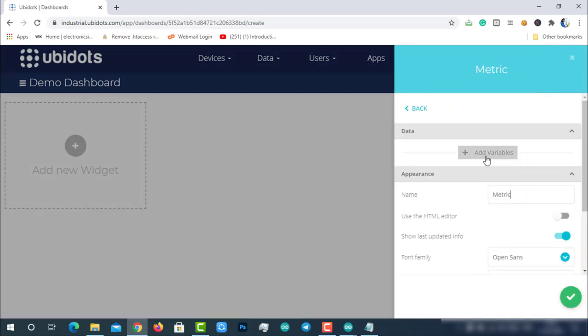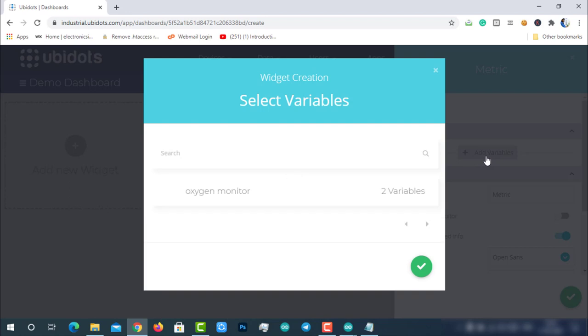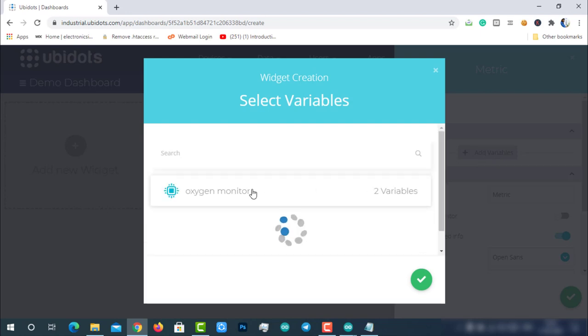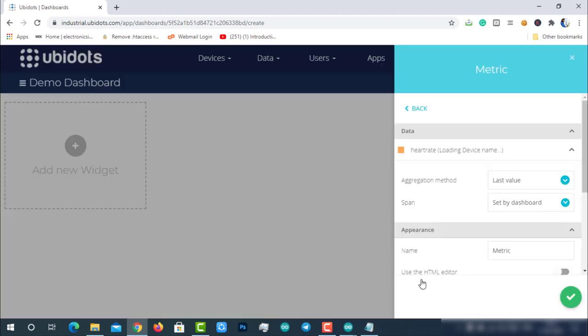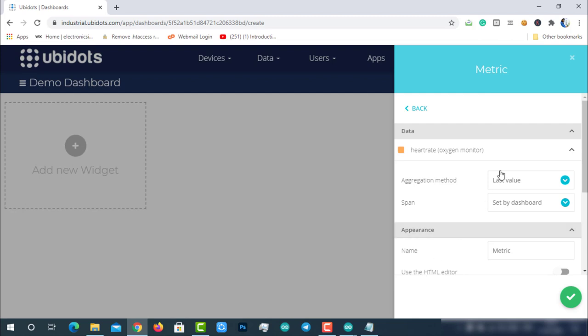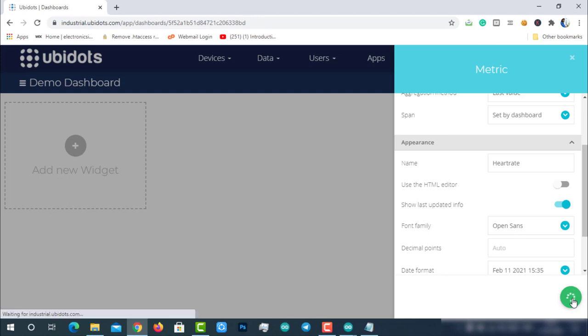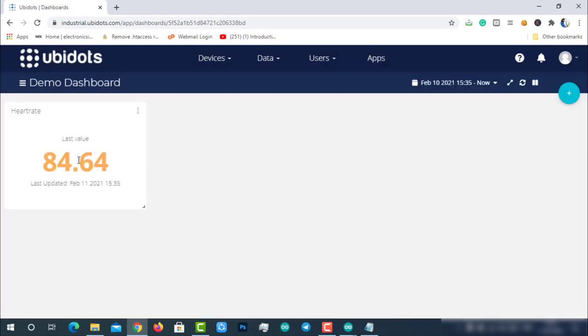I will use a metric to display the heart rate. Click on add variables, then select the device oximeter, and then select the variable heart rate. Add a name for the metric. Keep the rest of the options default, then create it. After creating, you can see the live data on the dashboard.